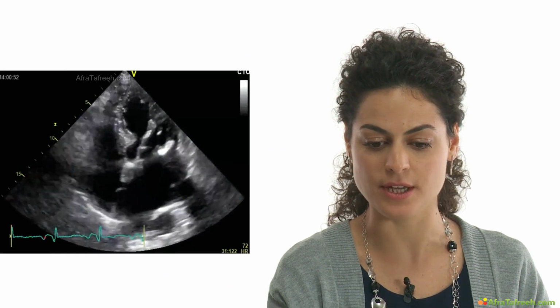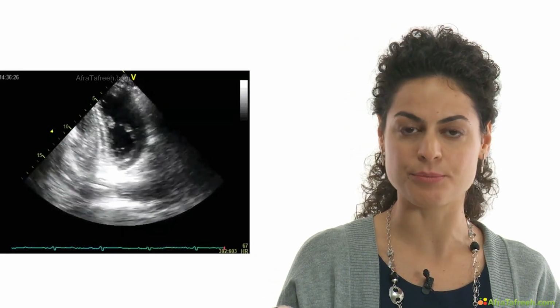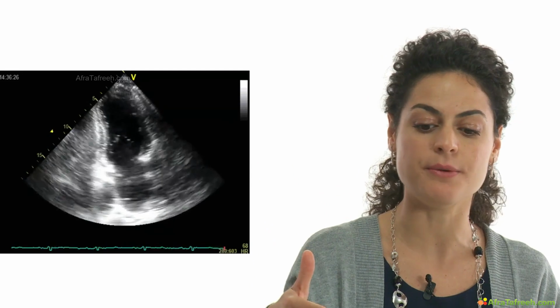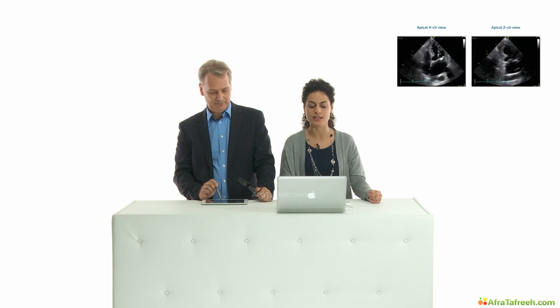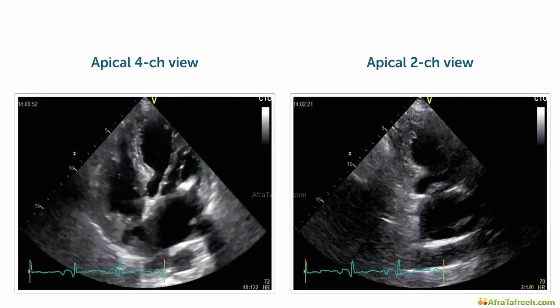And the same thing we can see, but in its length, in the 2-chamber view, just by tilting the probe more caudally. With this movement, we lose the left atrium, we look more posteriorly at the descending aorta in its major length. So, just for a review, we can look at the descending aorta in the apical 4-chamber view and 2-chamber view. And sometimes you will see pathologies there.